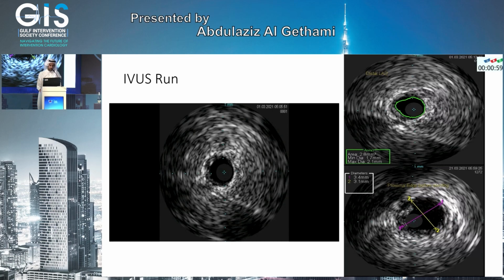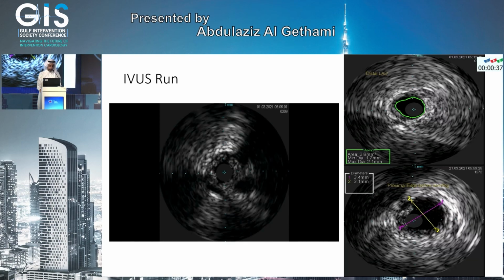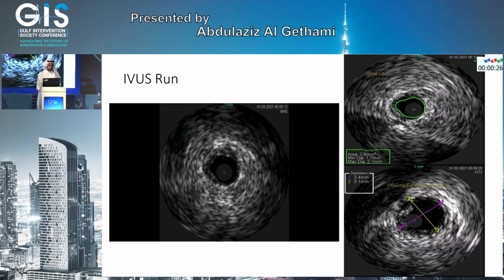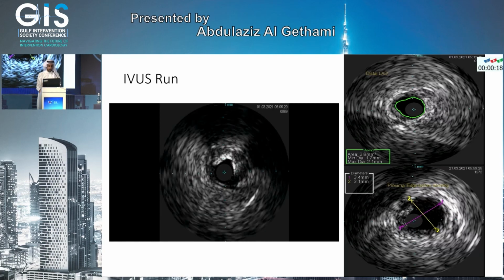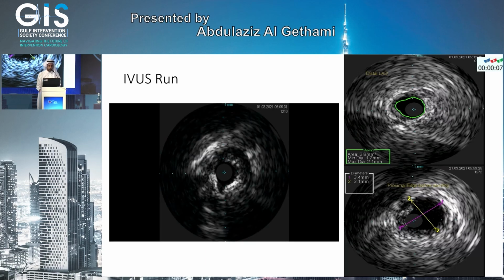The distal vessel is around 2, proximal is around 3.0 or 3.5. If you run the images on the OCT, on the IVUS, you will see the calcium arc in the middle. And after the lesion, you can see the opening of the diagonal in a good size, where it is coming in, which is a little bit reassuring. There is not a lot of publication about that, but maybe in the future we can get used to it more, and the patient might have more reassurance about what we are going to do. So this is the calcium, and the diagonal now coming in, which is a good vessel size, from the perspective of the ostium taking over.